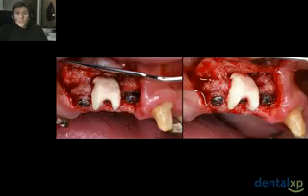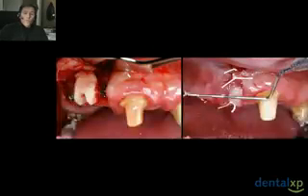So what we're seeing here is implants placed into a previously grafted area and then an allograft block. This is a J block from Zimmer, Tutogen. This is irradiated bone utilizing the Tutogen concept, and this irradiated allograft block is then carved, and we utilize a stereolithographic model to shape the bone on a sterilized stereolithographic model. And as you can see here, the attempt is to support the soft tissue both horizontally and vertically.